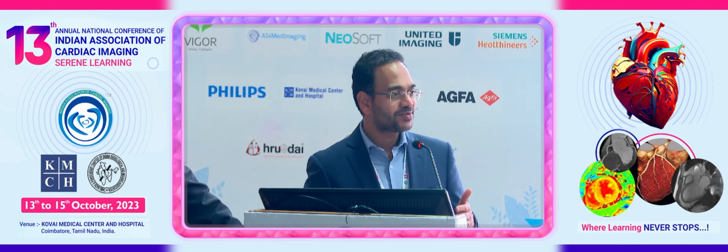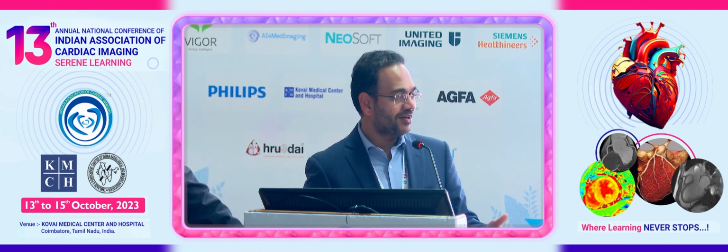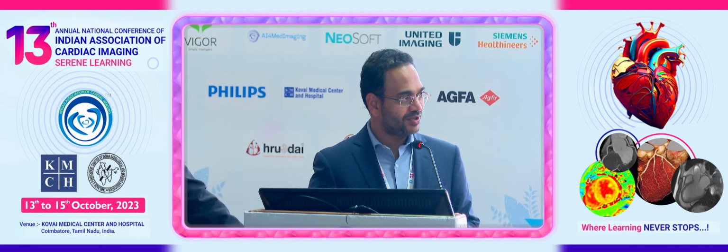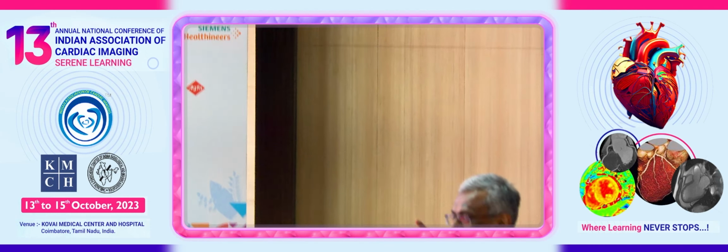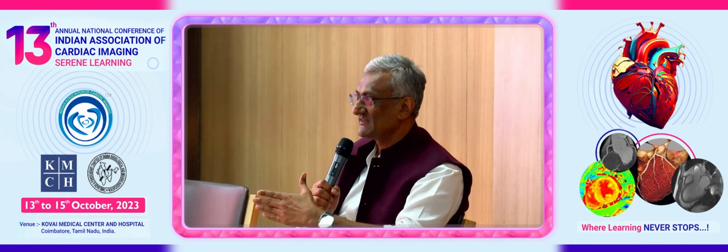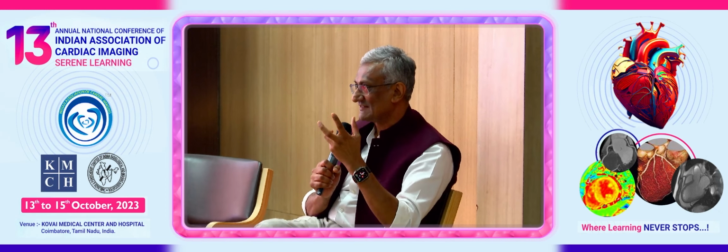And many of these patients, when they get the diagnosis of no plaque, no stenosis, then they don't get put on statin therapy, and then they come back many years later with acute chest pain in the emergency department, and that's why we need a study that will evaluate the temporal changes in plaque composition and high-risk plaques. We've seen anecdotally the other way around. That is, we've seen high-risk plaques in people on high-dose statins, coming back 2 or 3 years later with the plaques having calcified and reduced in size.